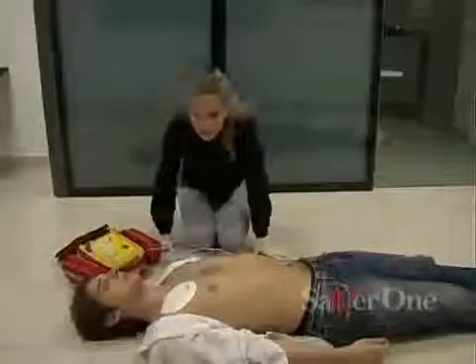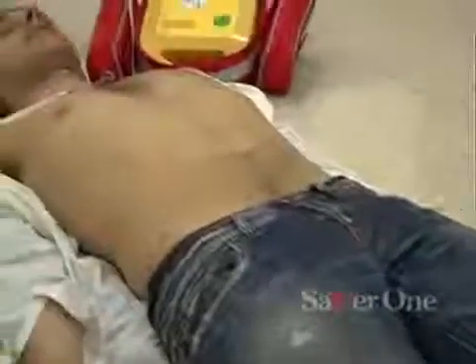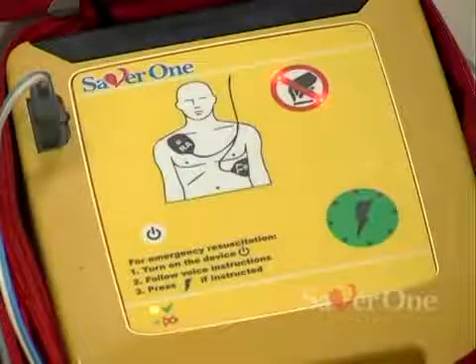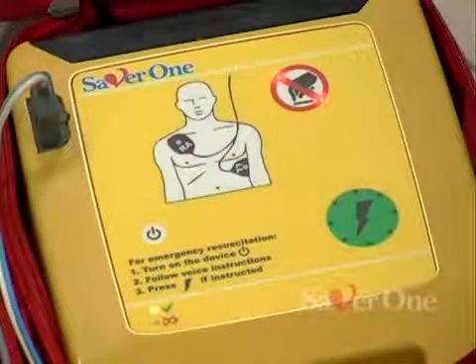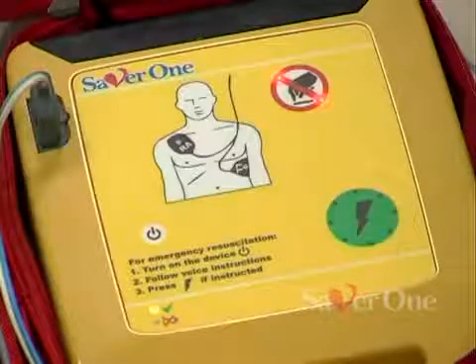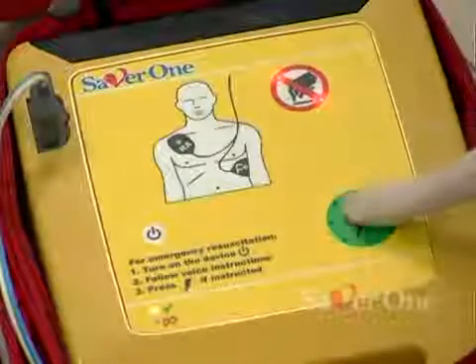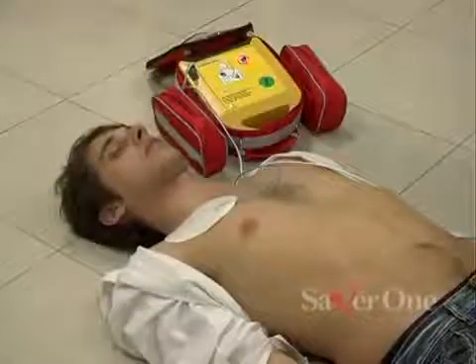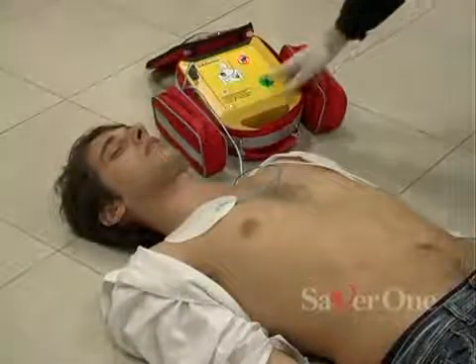Don't touch patient. Rhythm analysis. Shock advised. Charging. Press the green flashing button. The operator has 15 seconds to press the discharge button.